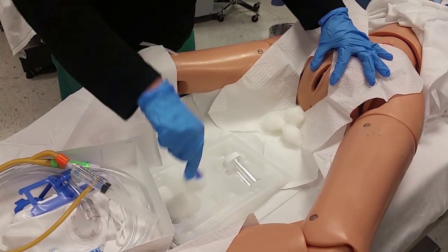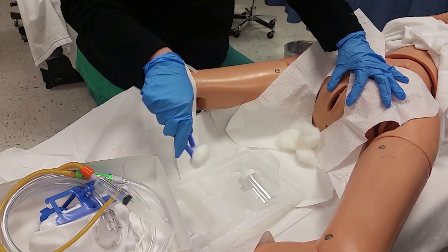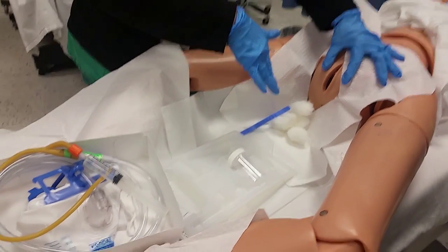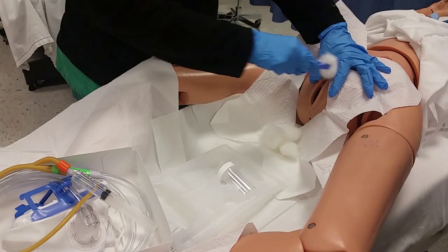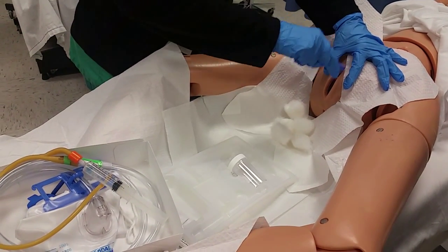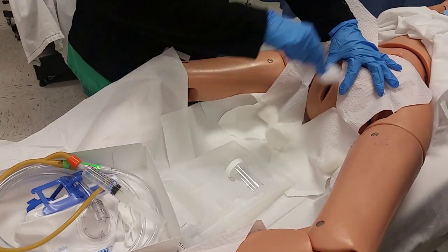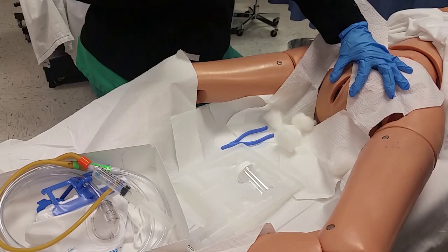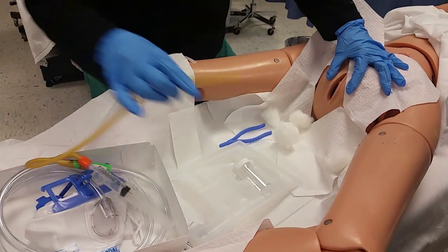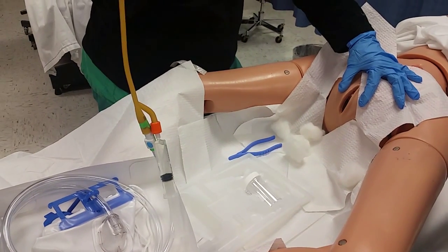Center. Center. Once you start to go to the center, that's when you need to start looking to see where you're going to insert your catheter. I'm going to go top to bottom and then drop all this, because this is all contaminated. You do not want to take a cotton ball and go back over. I always say: start at the top, bottom, and drop. You can drop it to the side — it doesn't matter, as long as you do not go back across.